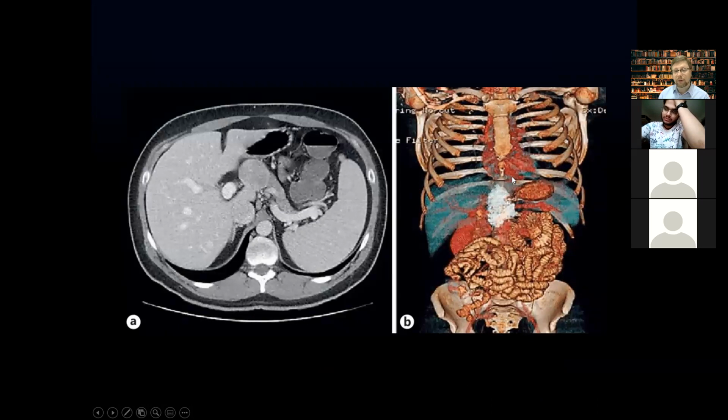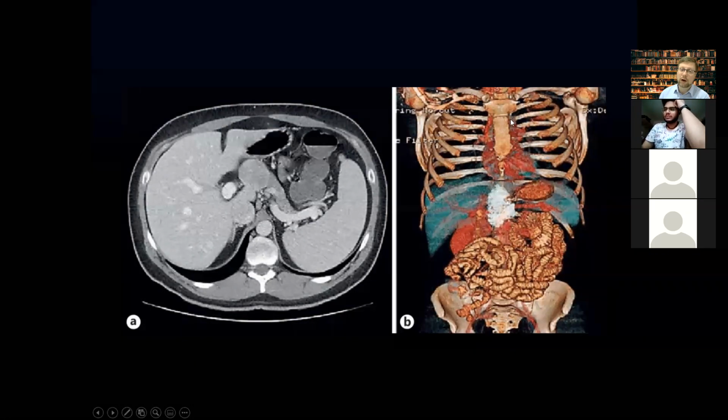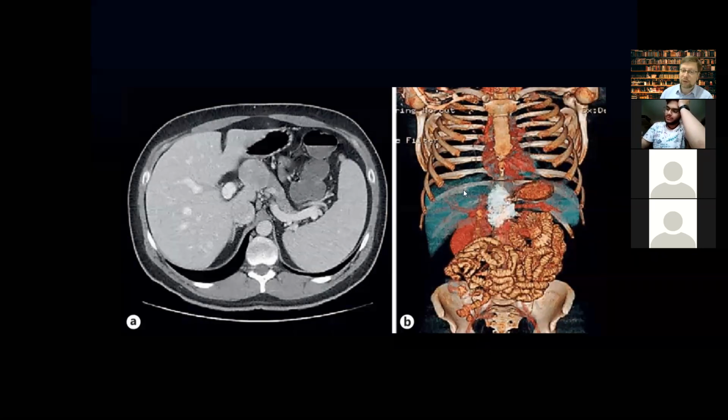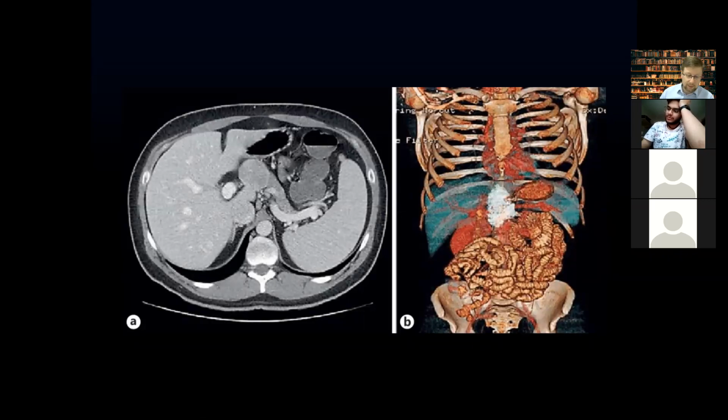And what is very important, based on this technique of computed tomography, we may perform 3-dimensional reconstruction of the organs. Right now it's not presented here, but very close to this image, we get such a cinematic CT. When we see a 3-dimensional reconstruction, it is like the image that you saw in the anatomical museum of our university.